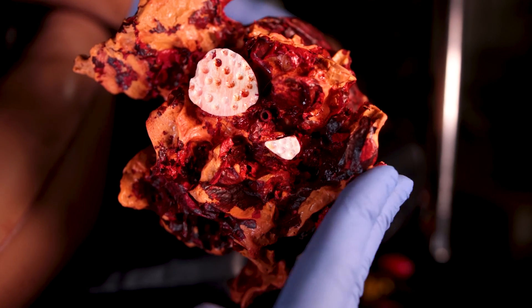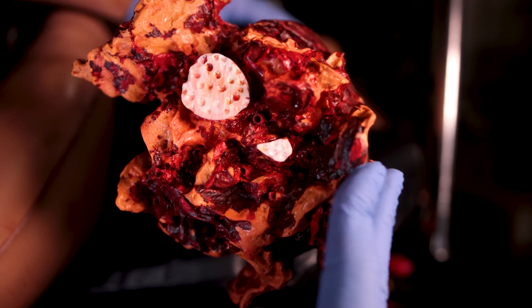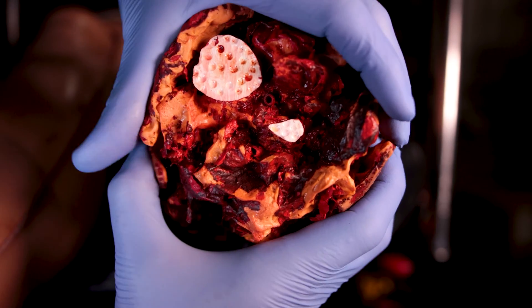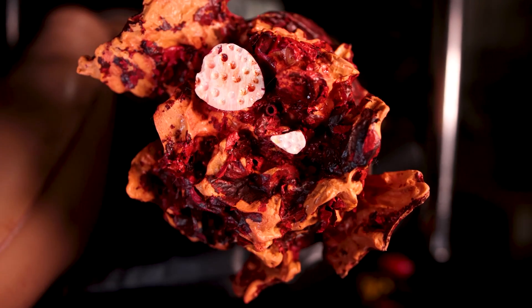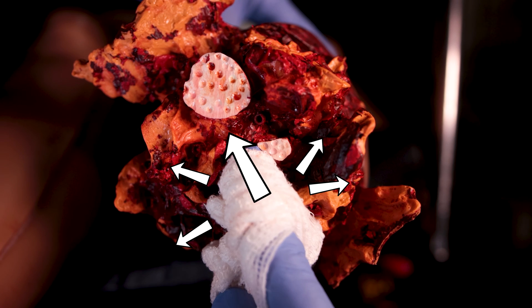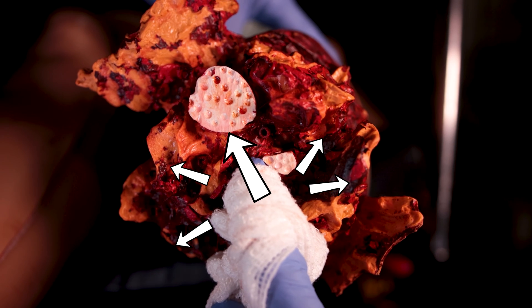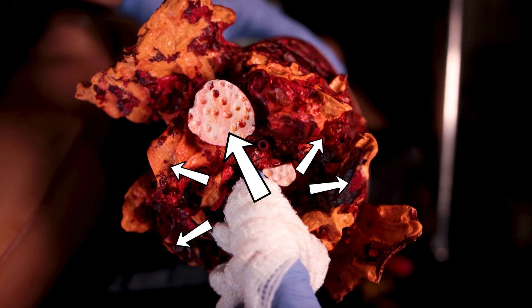Unlike the direct pressure technique, which compresses only tissues superior to the injured site, or a tourniquet that uses circumferential pressure to completely cut off blood flow to the injured site, wound packing combines two different pressures — digital and multidirectional — to maintain the balance between intra- and extra-luminal pressure. Just look how cool it looks in practice.